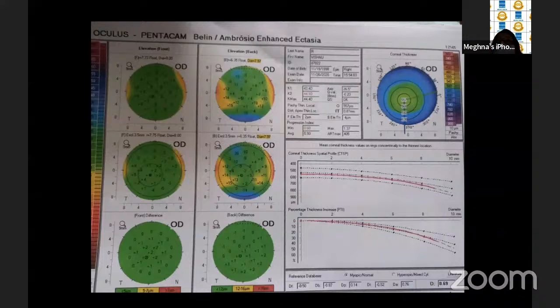So it further enhances the difference between the elevated area and the keratoconic area. If we look at the BAD value, it is 0.69 in this. Ma'am, less than 1.7 is normal, 1.7 to 2.7 is suspect, and more than 2.7 is keratoconus.